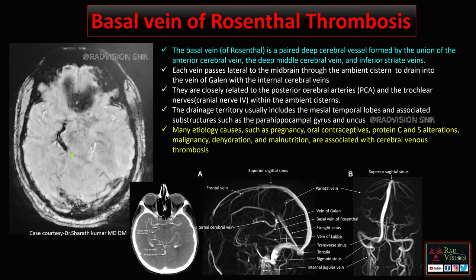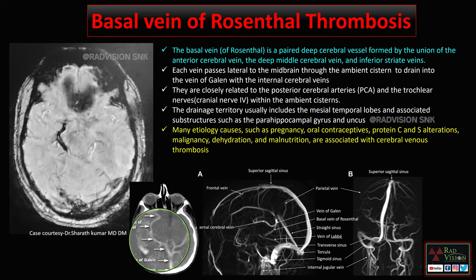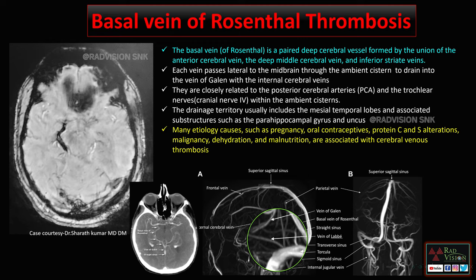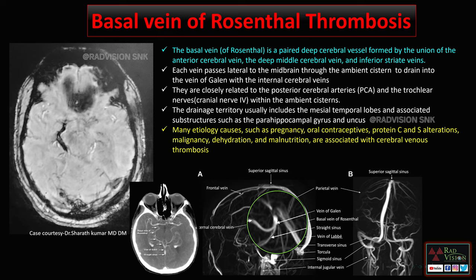The basal vein of Rosenthal is a deep cerebral vein formed by the union of the anterior cerebral vein, deep middle cerebral vein, and inferior striate veins. Each vein passes lateral to the midbrain — here you can see it passes lateral to the midbrain — and drains into the vein of Galen. Along with the internal cerebral vein, it drains into the vein of Galen.